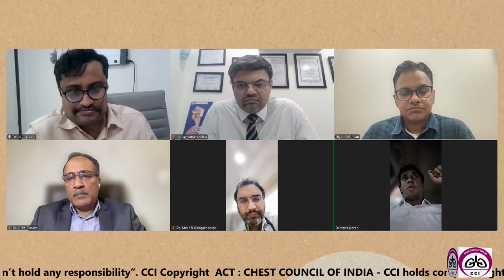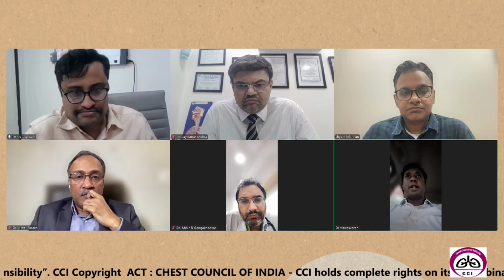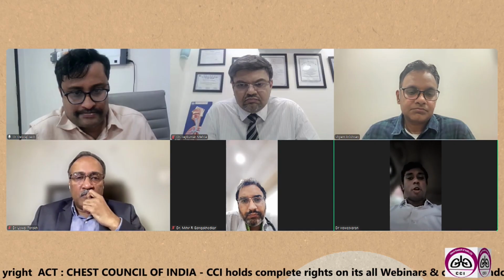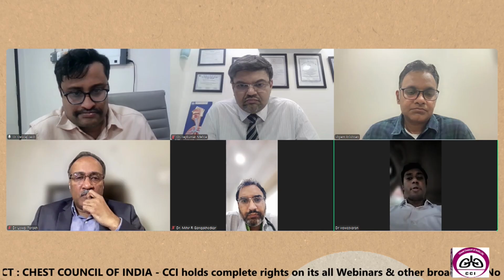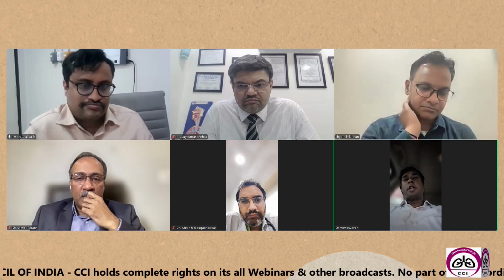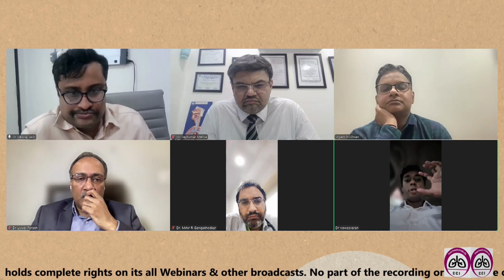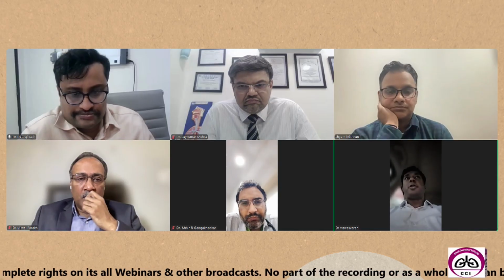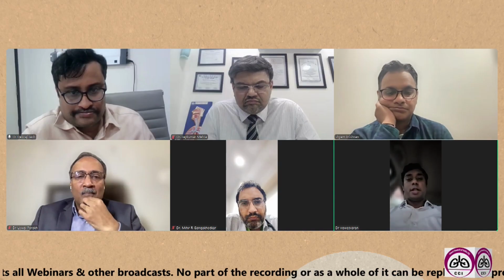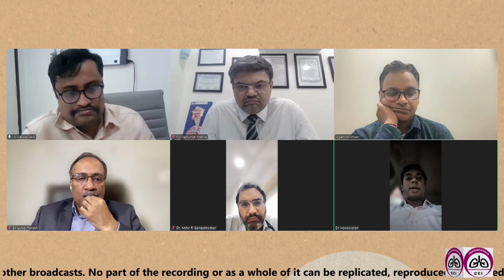What happened was she put the electrosurgical knife in. We activated the knife, and after that we were not able to actually see the node. The node vision was gone. We were able to see only haziness. You try to rotate your scope at the same place and everything, nothing was seen. This node which was seen very clearly, now you are not seeing anything. You are seeing only grayscale on the EBUS image. That time we didn't realize. Then she abandoned the procedure.